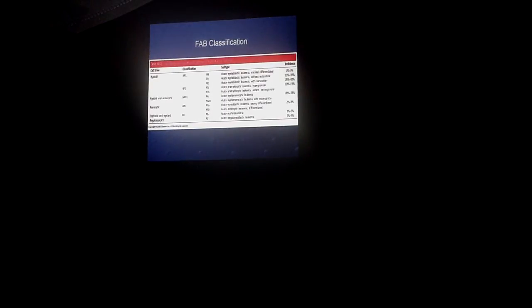Kasi most of the time, itong mga monoblast, precursor of the monocytes, and then the lymphoblasts, the precursors of the lymphocytes, you will not be able to see them in the bone marrow smears pag normal. Hindi na lang natin sila isali sa slide discussion today. And then, what are the precursor cells of the platelets? Megakaryocyte. The megakaryocytes.